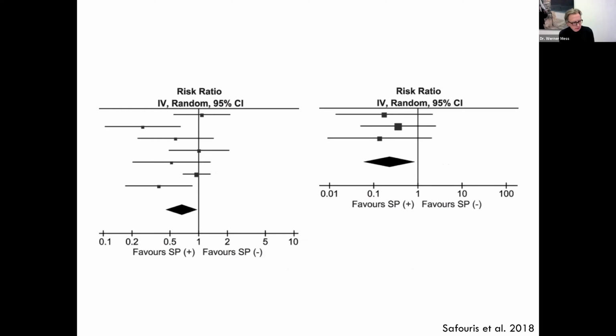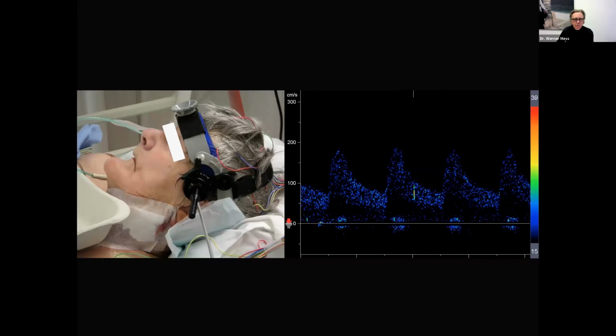This is on statins. It is known that if people are on statins for whatever reason and they get a stroke, the stroke is usually milder than without statins. And here embolus detection has been done, and indeed, if people had statins before the event, there were much fewer emboli, and if the statin dose was pretty high, then the effect was even more pronounced. So again, another indication that microembolic signal detection evaluates the function of medication.